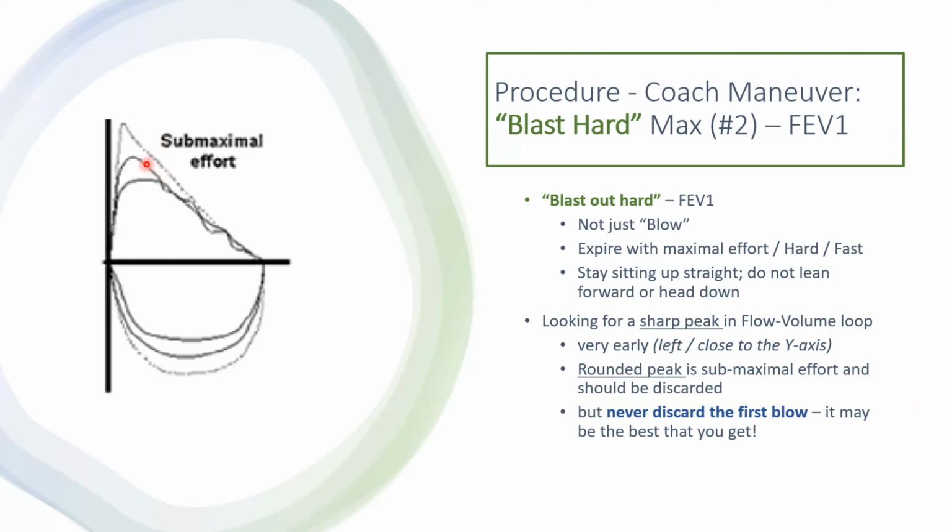And a rounded peak is a sub-maximal effort that should be discarded, but never discard the first blow. For plenty of patients, the first blow is the best you're going to get. Never discard that first one.